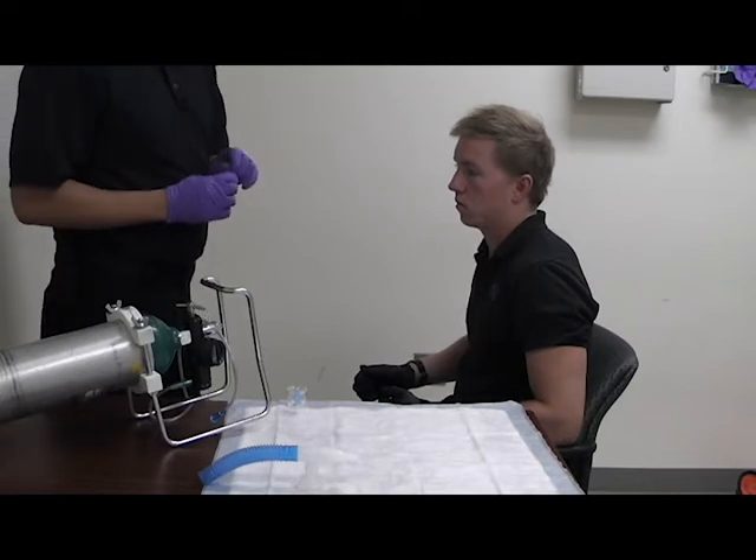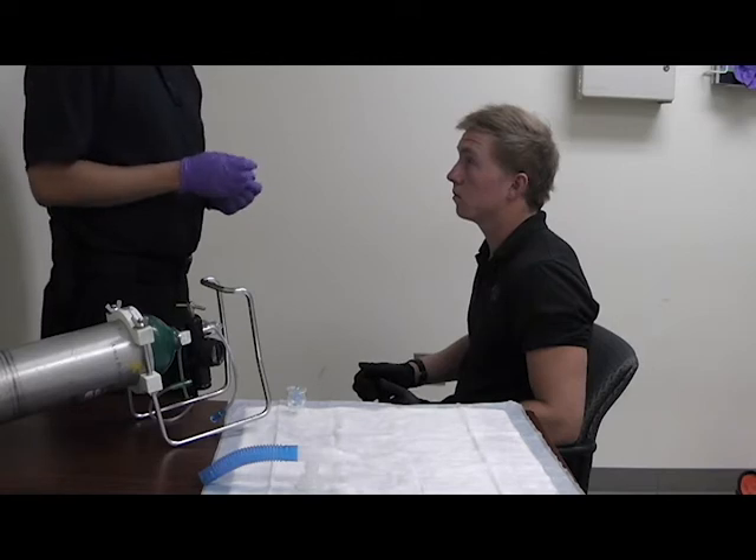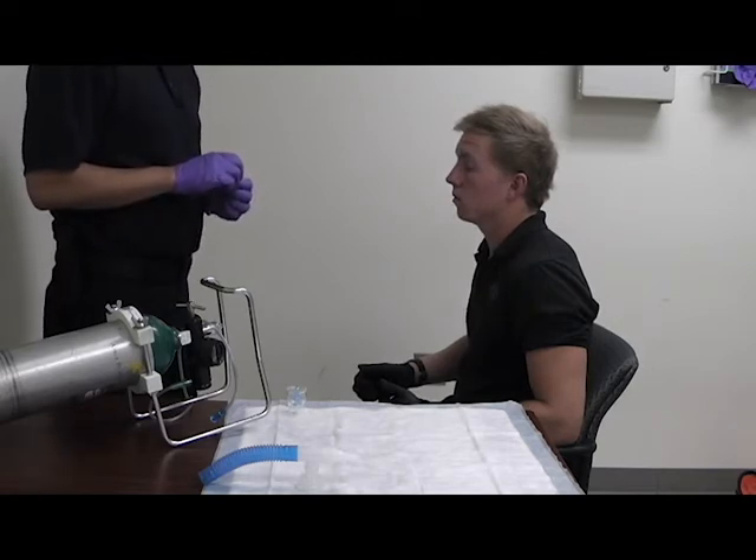At that point, I'm going to run through Dr. PATS. This is the right drug, right amount we're going to be giving it, right route — we're going to be giving it through nebulizer.